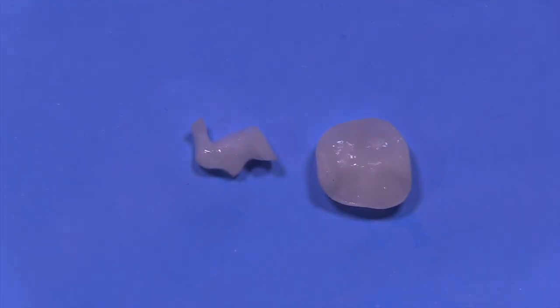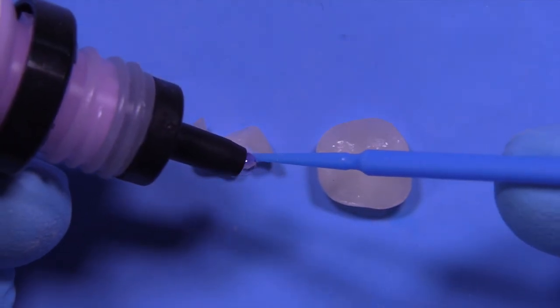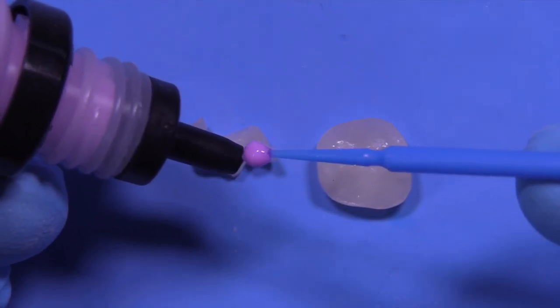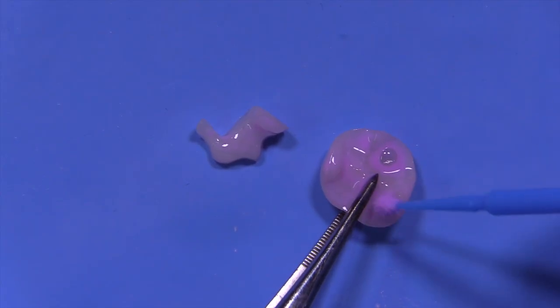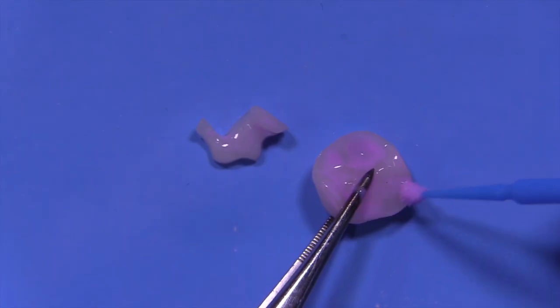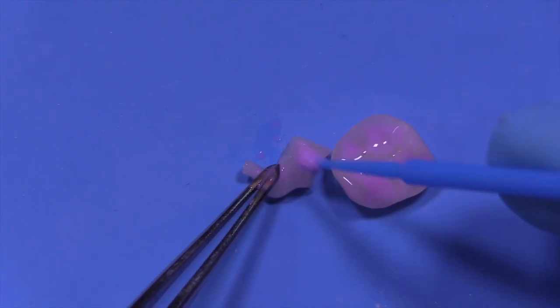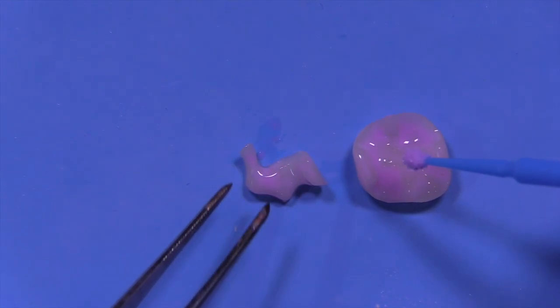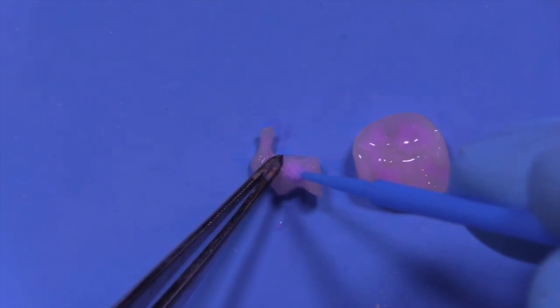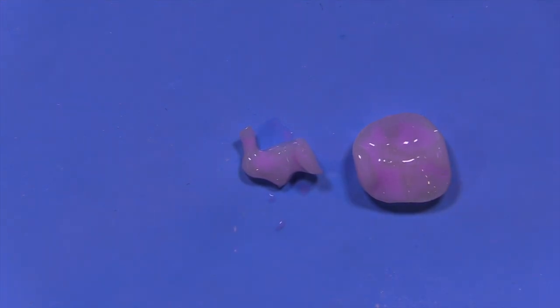This is IvoClean. After you've tried the restorations in, you've got debris, saliva, and salivary glycoproteins all over them — even if the rubber dam is in place. This is just a cleaning paste with some zirconia particles in it. This should never be used in the mouth — don't ever put this on teeth or expose your patients to it. Use it away from the patient: just scrub it on the bonding surfaces of your inlays and onlay, then rinse it off and blow it dry.